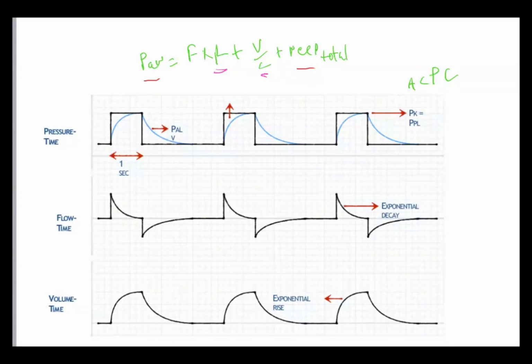But I think why it's generally taught and understood that pressure control is better for the patient because it's more comfortable is that in pressure control, the patient has more freedom to do what they want if they're interacting with the ventilator. So they have more control over how much volume they get. Now, you as the clinician or provider, whoever's setting the ventilator, need to ask yourself, is that okay? If a patient has ARDS and you're really trying to adhere to 6 ml per kg, but the patient's taking big, long, deep breaths because they have a lot of dead space or they have sepsis, whatever it is, and you put that patient on pressure control and they can breathe freely, they might not breathe at 6 ml per kg. So even though it's quote unquote more comfortable, it might not be what's best for the patient at that time. So you need to take over control in some way.